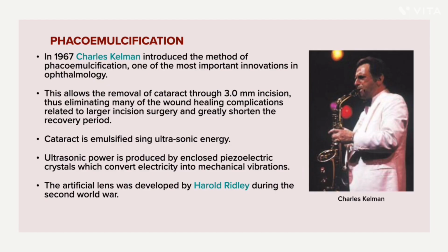Now, after that, phacoemulsification, which was introduced by Charles Kelman in 1967, revolutionized cataract surgery, and it allows cataract removal through a small 3 mm incision, reducing complications and speeding recovery. The lens is broken down using ultrasonic energy. The energy is generated by piezoelectric crystals, converting electrical energy into vibrations. Along with this, the first intraocular lens was developed by Harold Ridley, which further improved visual rehabilitation. Overall, phacoemulsification represents a major shift towards minimally invasive, faster and safer surgery.